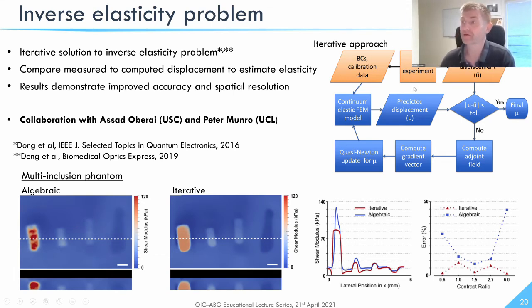We performed this originally on the version when we just have the axial component of displacement. That increases the likelihood of errors because we don't see the full picture. So we think incorporating the 3 components of strain with this will constrain the problem sufficiently. But I think the key point is that if you were directing the question towards breast cancer, I would say it would be very difficult because it's such a complex tissue.